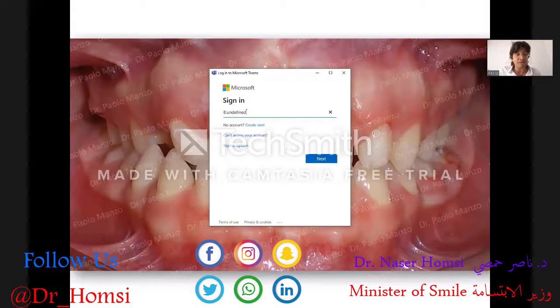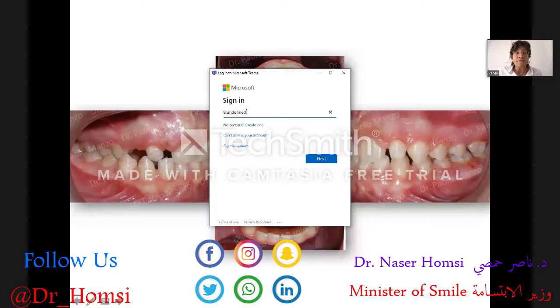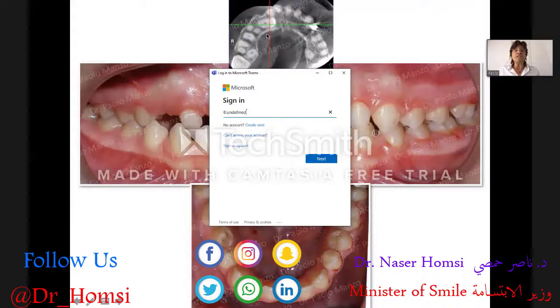We have a dental midline discrepancy, crossbite on the lateral incisor, okay? And I asked, if possible, when you speak with your doctor, ask him to remove everything except the ligature on the canine, so we can spare your daughter a new surgical phase. And actually, it was very kind of him to leave this ligature on the upper canine, so we don't need a new surgical phase. If you see, this is the impaction of the canine, and I started with this treatment.